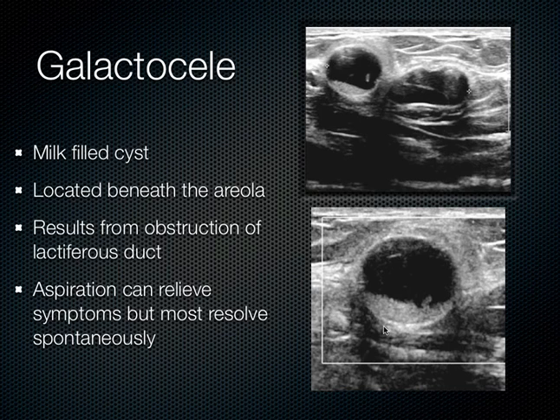When galactoceles are new and composed mainly of milk without any separation, they appear more as solid masses with increased posterior acoustic enhancement. As the galactoceles age, the fat, water, and protein content separates, and they become more cystic in appearance. And typically with ultrasound, a fluid debris level can be seen, and as the patient moves around, this fluid debris level can shift.